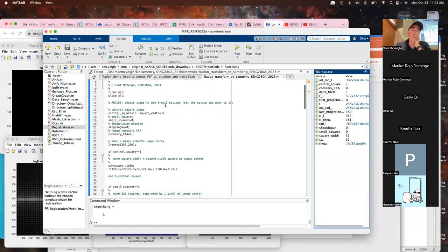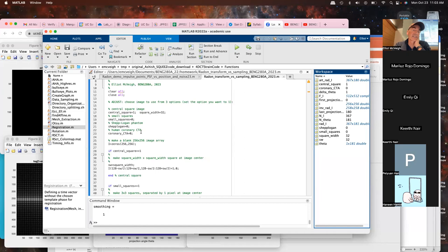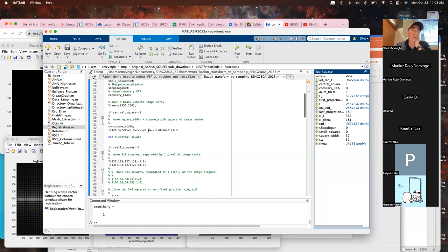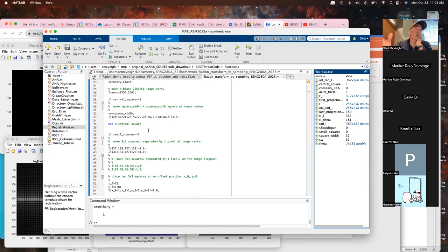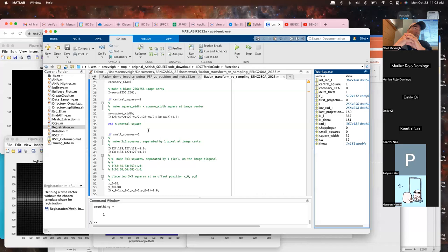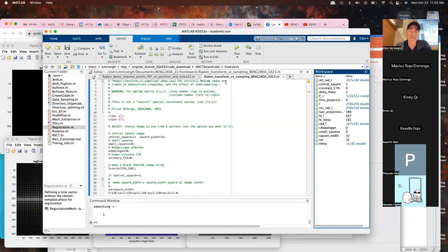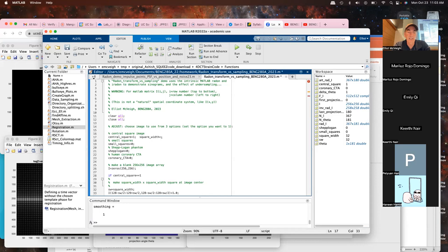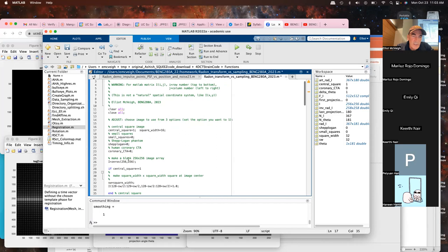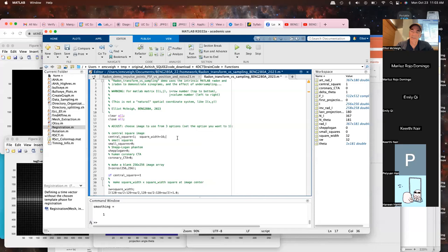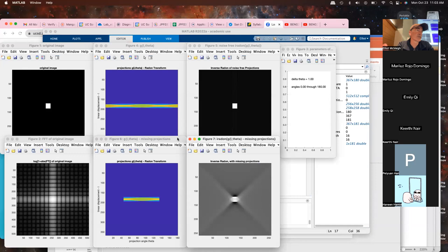You can pick an image to see what the radon transform — what g(l,θ) — looks like for that image, then modify sampling parameters: change the number of projections, change the angle between projections, and see how that affects image quality. The first script is called 'radon transform versus sampling.' It has four images; one is a central square whose width you can set. It's a 256×256 image. On a Mac, just press Command+Return and the whole MATLAB script runs, plotting labeled figures.